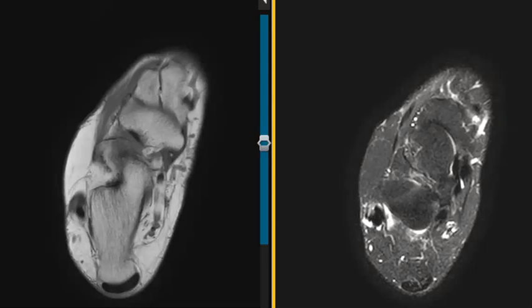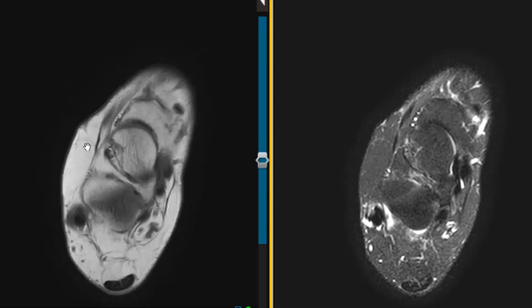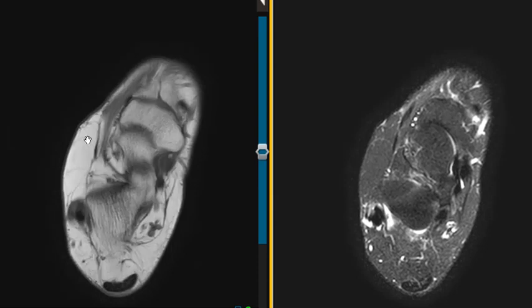Hello, this is Dr. Gay from First Look MRI, and this is a 55-year-old woman who has pain in the lateral ankle. She has a tear of her Peroneus brevis tendon, but that's not why I'm showing the case. I'm showing the case because of this. There's an area of fat here, and we see commonly in the foot and ankle fat collections like this.